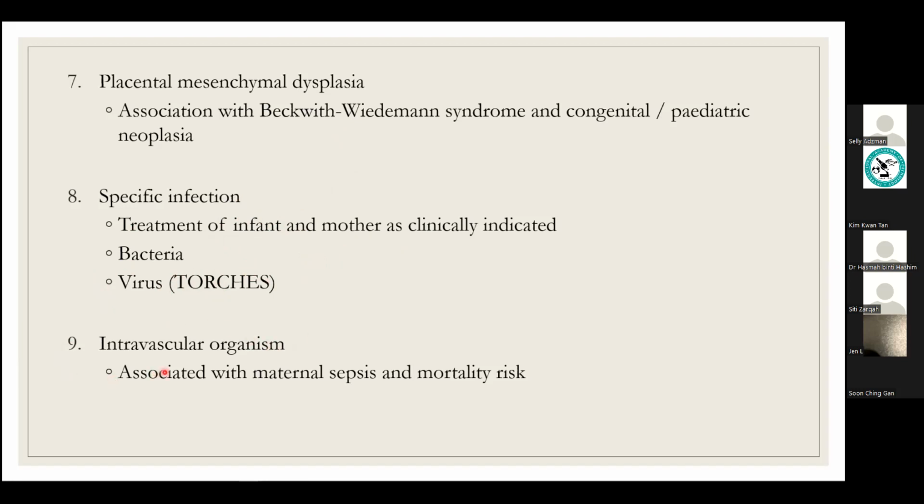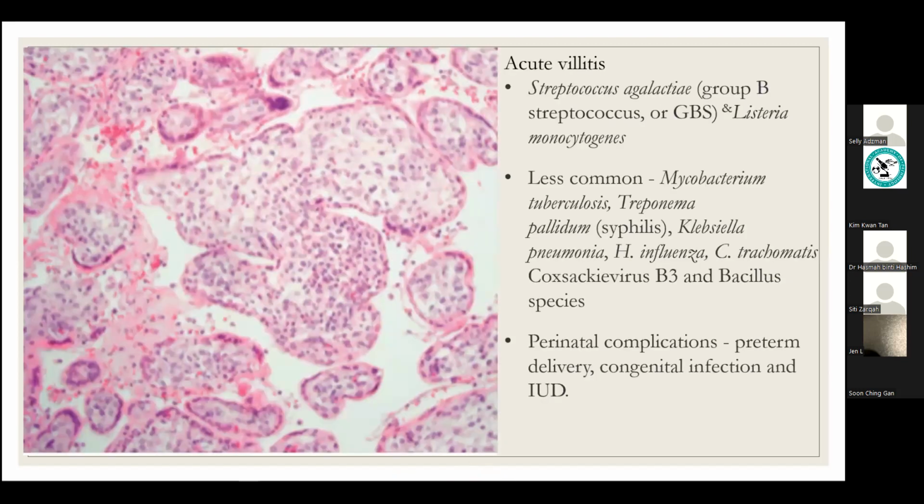Okay, another thing is intravascular organism. So it's associated with maternal sepsis, so mom might need extra treatment, something like that. Sorry for the blurred picture. I just want to show you this is acute villitis.